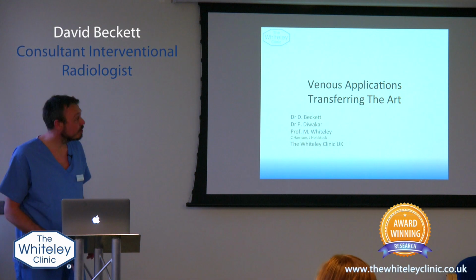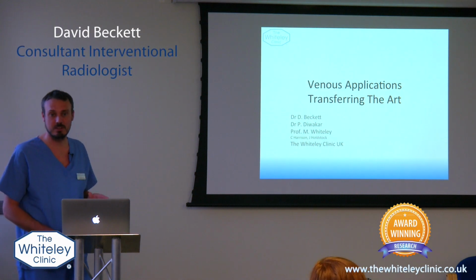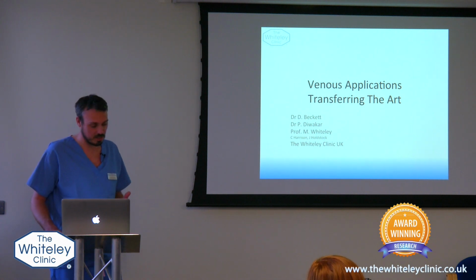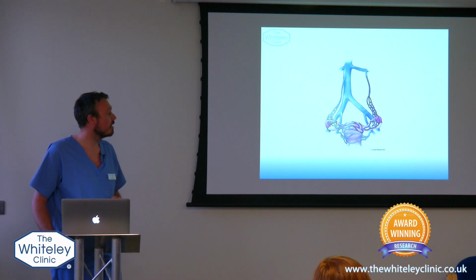Okay, so now we're just going to talk a little bit about the procedure itself, and then at the end we've got a video of an actual pelvic vein embolization procedure, or certainly parts of it.